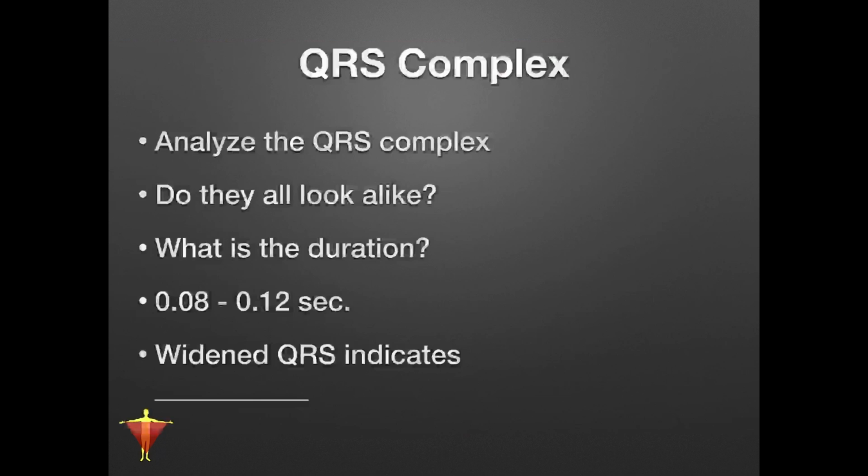So that's how I imagine it, it's just taking a detour, and it has to go around possibly an area of the heart that the electricity is not moving through correctly. Could be a previous problem, but that's why we end up with these really wide QRS complexes, or what we would identify as a bundle branch block. And depending on other things, we would need to look at a 12 lead to know whether it's coming from the left or the right. But that's just a little bit extra information for us to know.